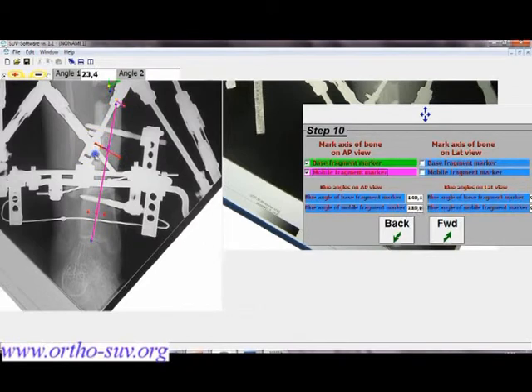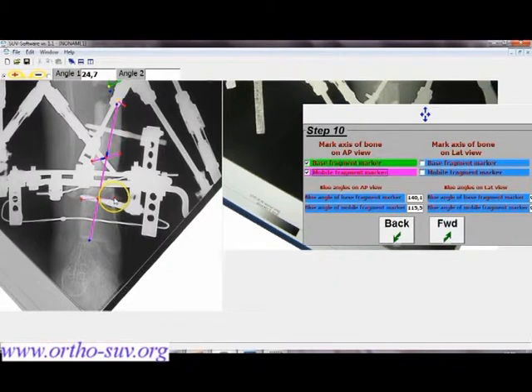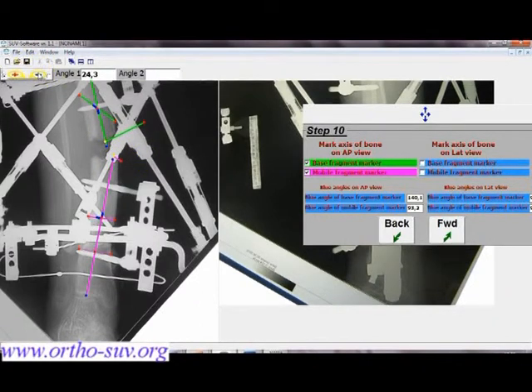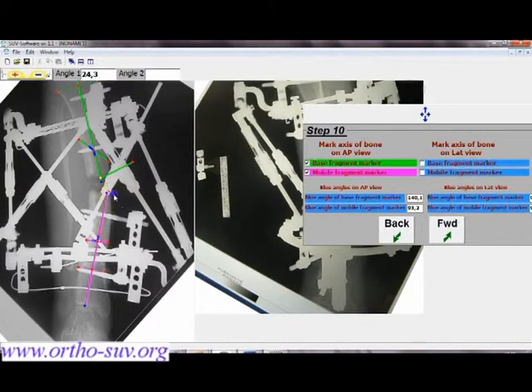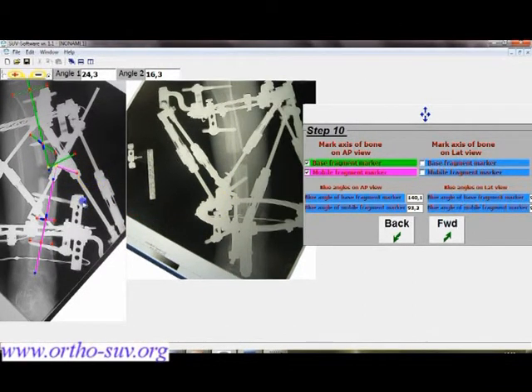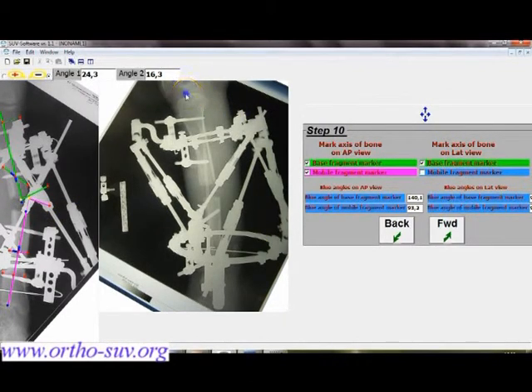Then we make the same procedure with the distal fragment marker — the pink tree — but there is one difference. First, we align the red points with the borders of the distal fragment to get a good axis. The difference from the previous case is that here we have a gap. When there is a gap, we must place the yellow points of both markers at the same horizontal level. So we align the yellow point of the distal marker with the yellow point of the green tree — you can see the yellow points are at the same horizontal level.